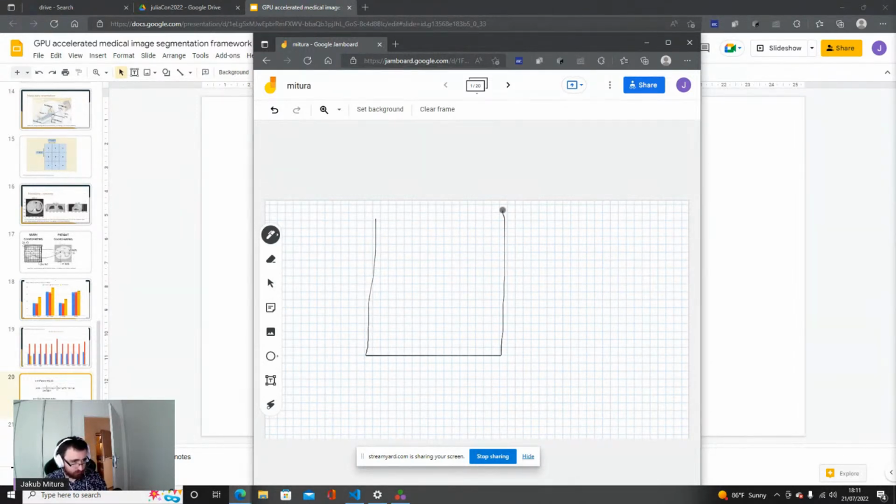First of all, let's imagine the common problem that we have the lungs, and in the lungs we are looking for tumors. What is important from the numerical perspective is that the tumors are relatively small, or can be at least relatively small, relative to the whole volume.